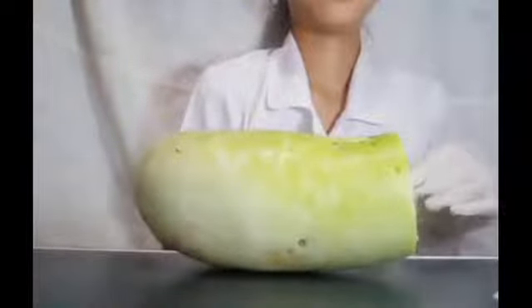I have here the insulin syringe, just to pretend. This looks a little bit different than your other syringes.